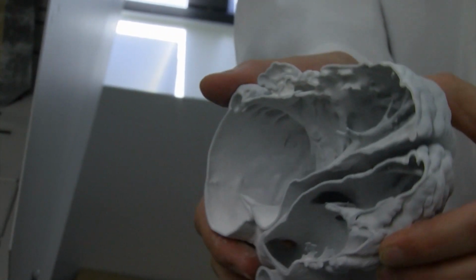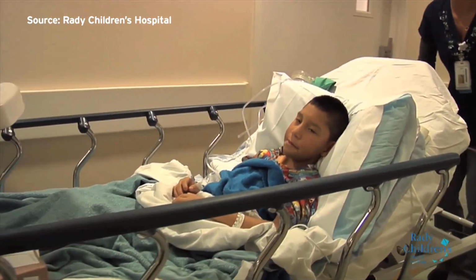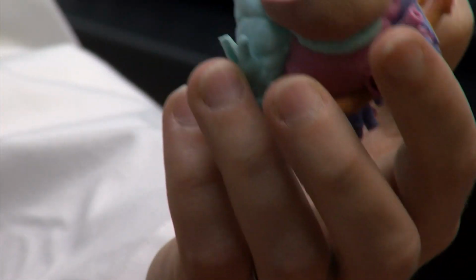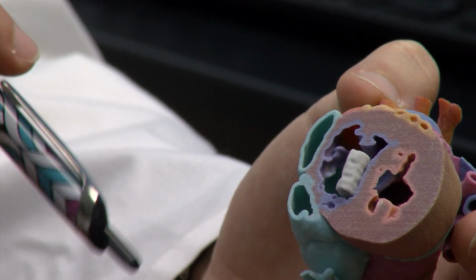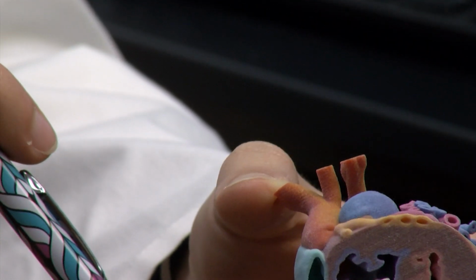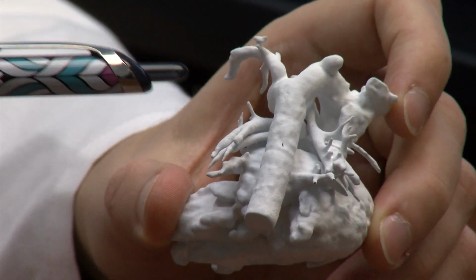Ryan says the 3D models help doctors plan for complicated surgeries and improve outcomes of the region's youngest patients. So in this patient, there's a hole which is kind of deep inside the model. Exactly how big that hole is can change the course of surgical correction. You need to know how big the patch needs to be, where that patch might need to be in order to fix that hole. We can also identify when there's a lot of tiny little blood vessels, which ones might be more critical to save or which ones can be sacrificed in order to help flow to other regions.